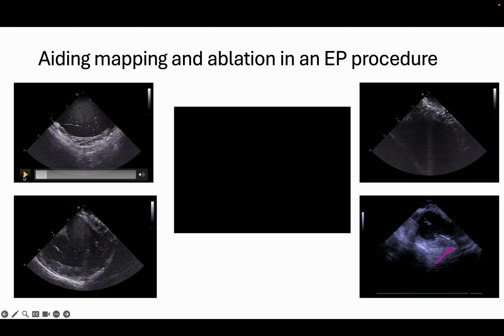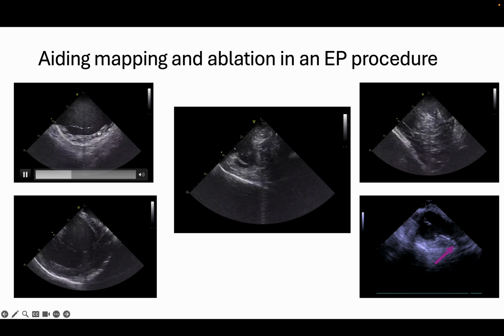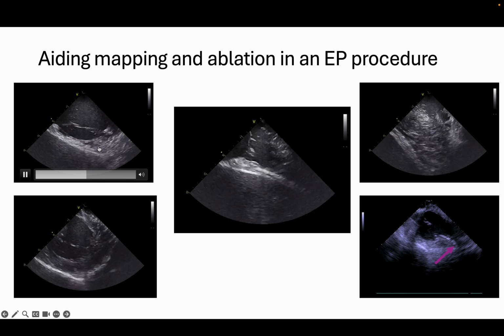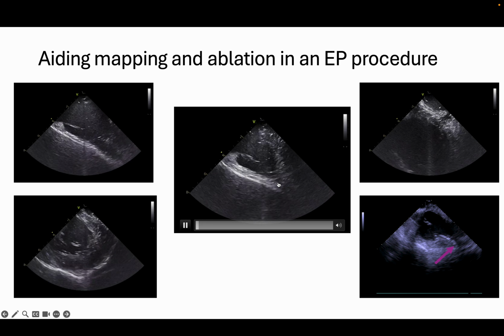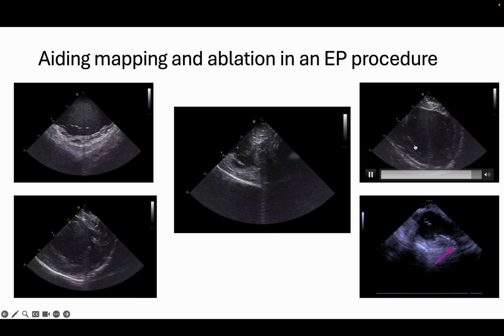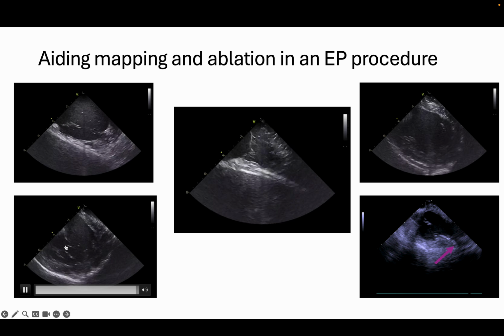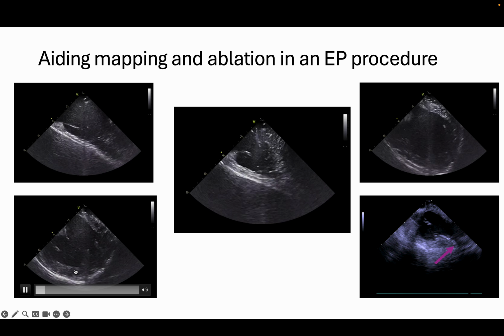Additional evaluations for the left ventricle start by getting the catheter into the inflow of the right ventricle, clocking from there, and as we clock we can see the moderator band, the apex of the right ventricle, and as we go on clocking from the apex of the right ventricle, we can start to see the left ventricle, especially starting from the apex, the papillary muscles, and as we clock further, we can actually see the mitral valve in the short axis.